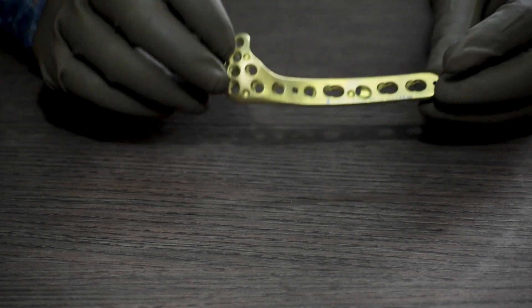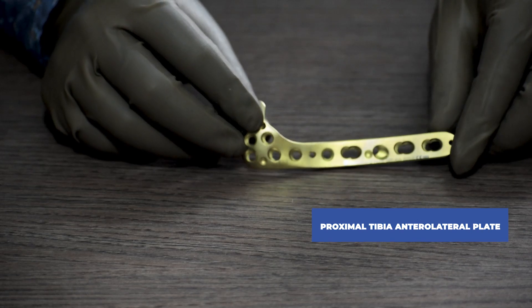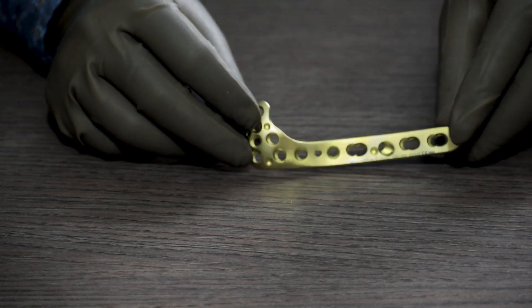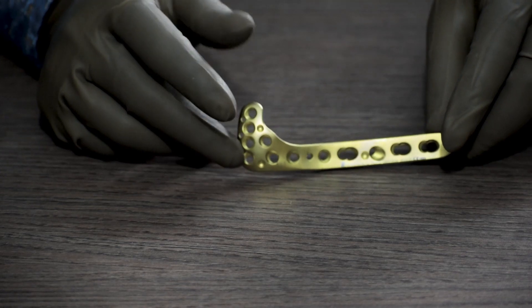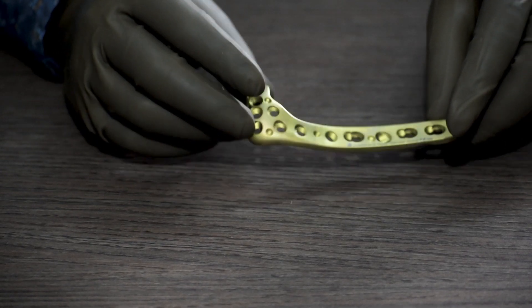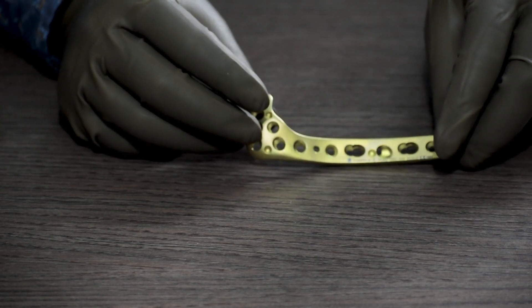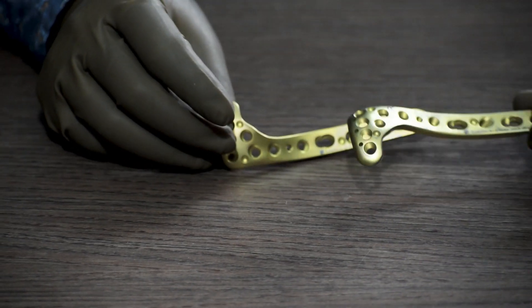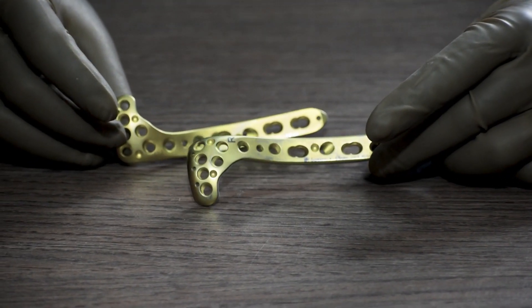Now we will take a look at the 3.5 system. To start with, this is the proximal tibia anterolateral plate. It is available in different sizes starting from 4 holes up to 12 holes: 4 holes, 6 holes, 8 holes, 10 holes, 12 holes. This is also a side specific plate, available for left and right leg.